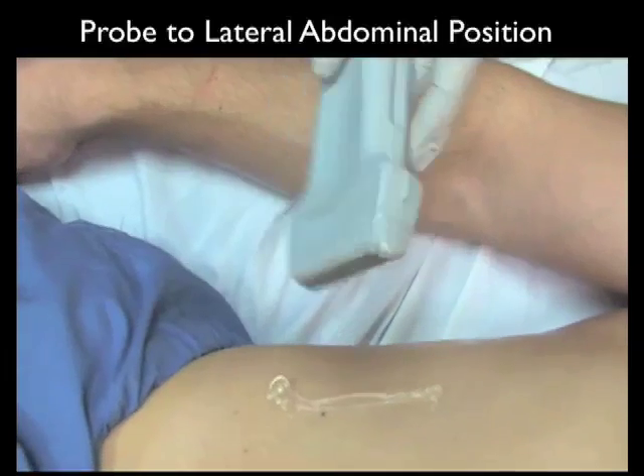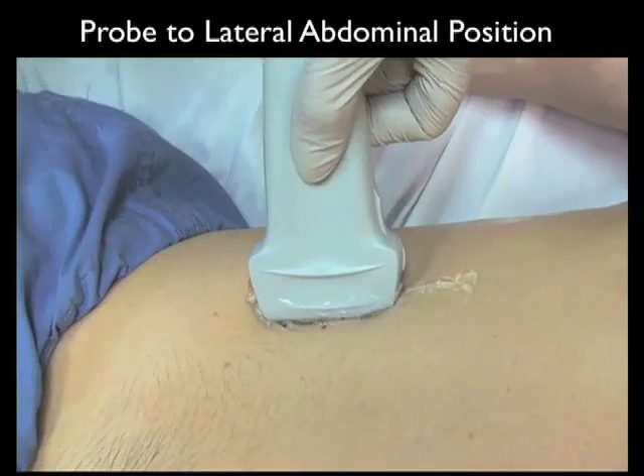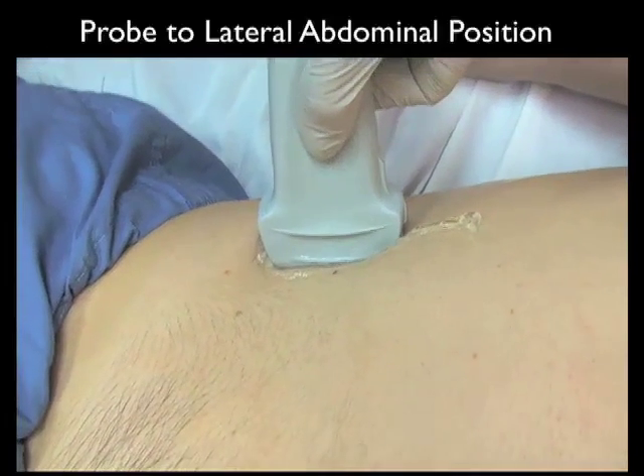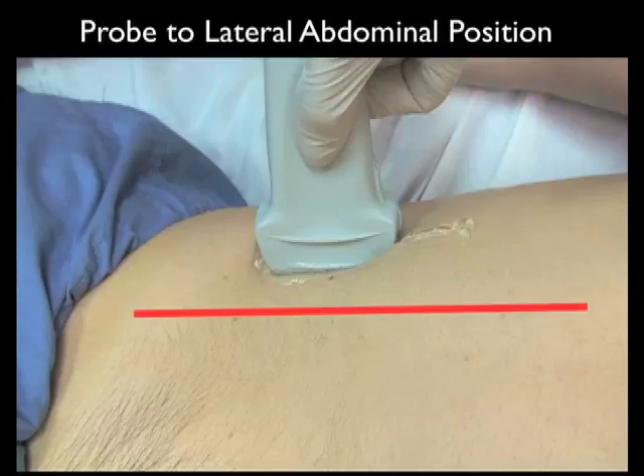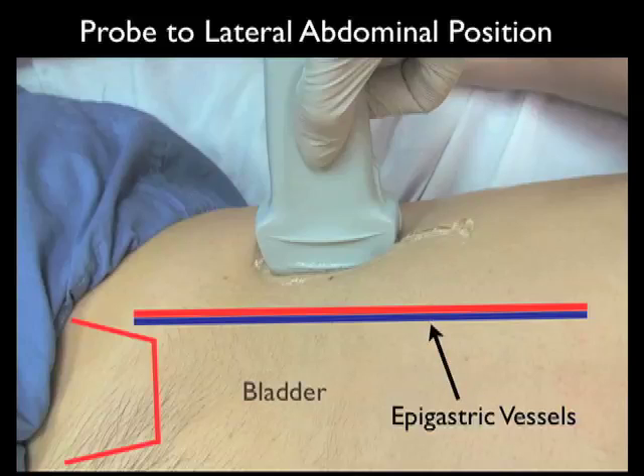Here's the location of the probe in the lateral position for the paracentesis procedure. Note the placement of the high frequency linear array probe above the anterior superior iliac crest along the lateral gutters. Notice the location of the epigastric vessels in relation to the lateral gutters — we want to avoid those epigastrics during any puncture attempt. Notice also the location of the bladder; we want to make sure we decompress the bladder prior to any puncture attempt for paracentesis.